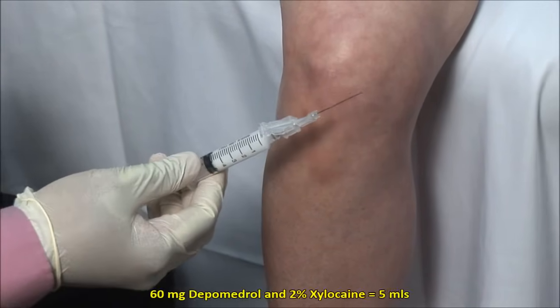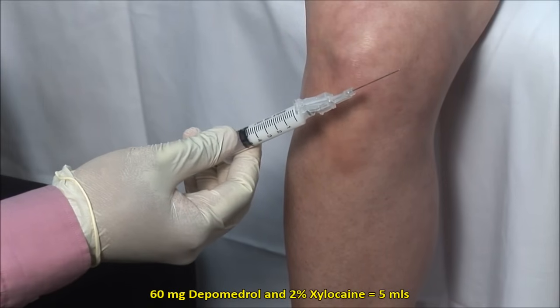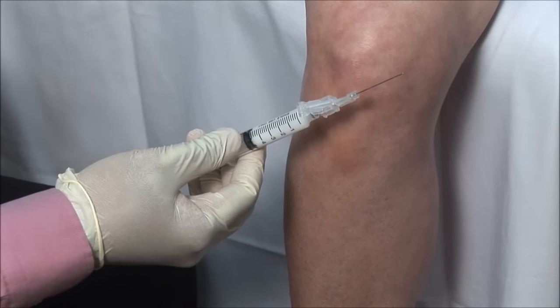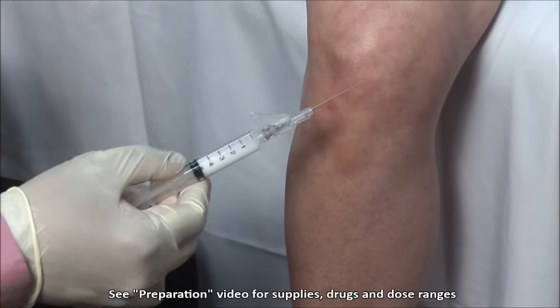Here I have a mixture of 60 mg of depomedrol mixed with 2% xylocaine without epinephrine to a volume of 5 mls. I am using a 22-gauge 1.5-inch needle with the bevel facing upwards.